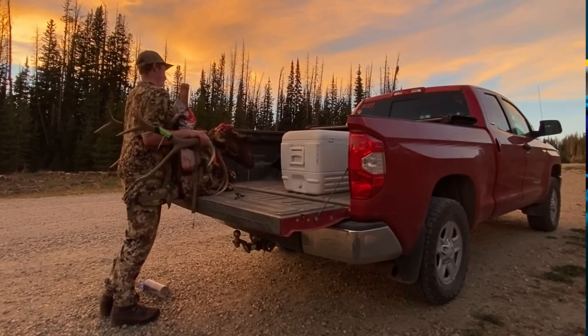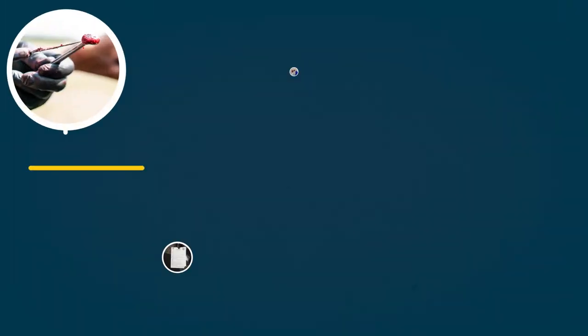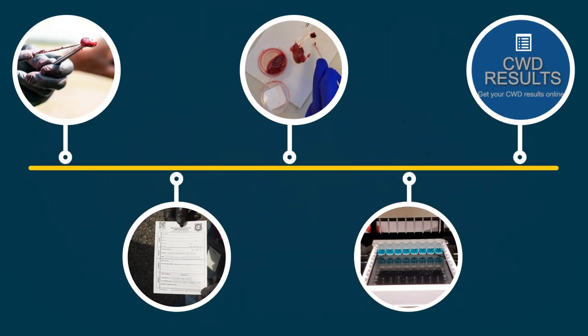Hunters often wonder how we test harvested animals for chronic wasting disease. We'll show you a sample's journey through the testing process from start to finish.